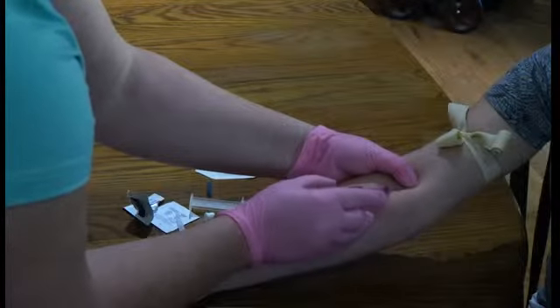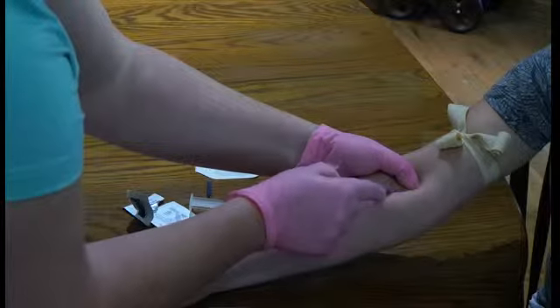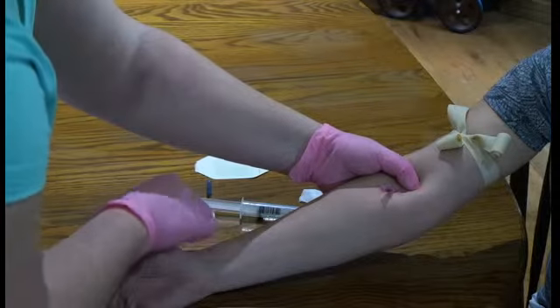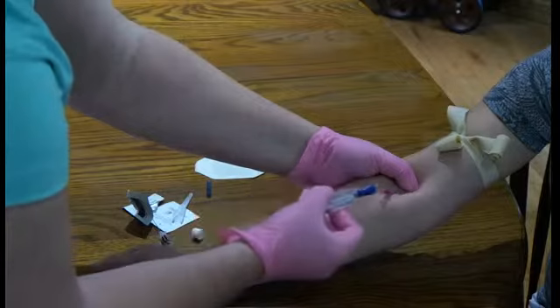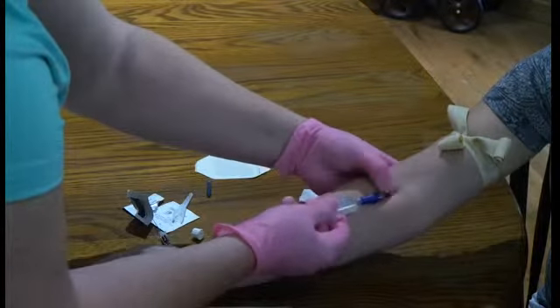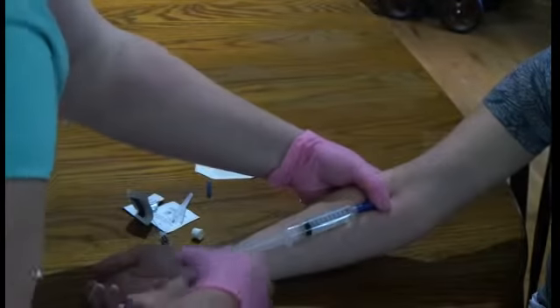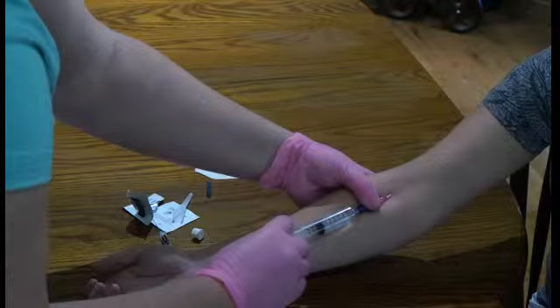Then you're going to place your other thumb over the top of the cannula so that it doesn't bleed any further. As you can see, I've pulled out the needle and there's no bleeding from that catheter. Then you're going to insert your heplock cap securely, remove your tourniquet, and then flush your IV to check for patency.